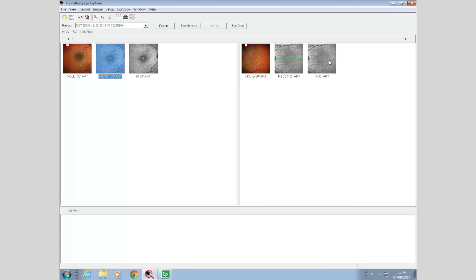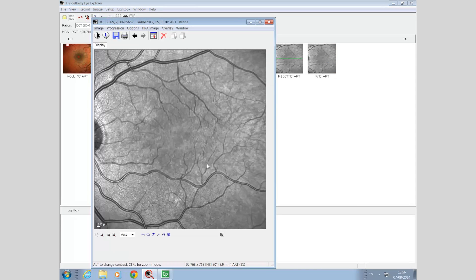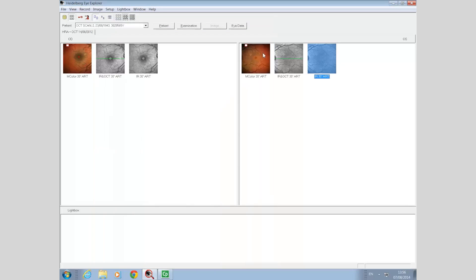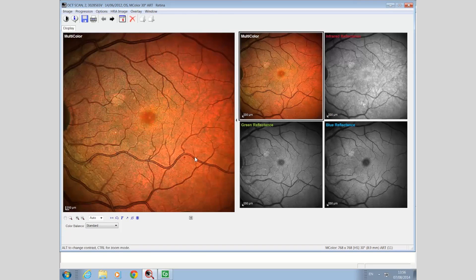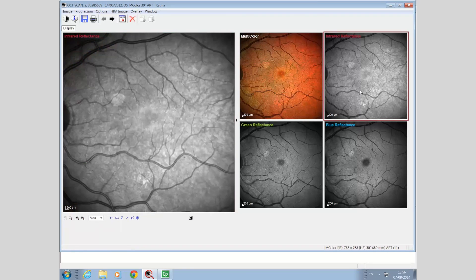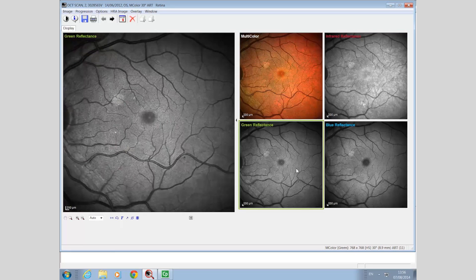The fellow eye infrared reflectance image shows a normal reflectance distribution with no obvious visible macular lesion. The multicolour image shows a normal colouration and a normal macular pigment appearance. The infrared reflectance shows no obvious lesion; the macular pigment is demonstrated more clearly on the green, but most particularly on the blue reflectance.